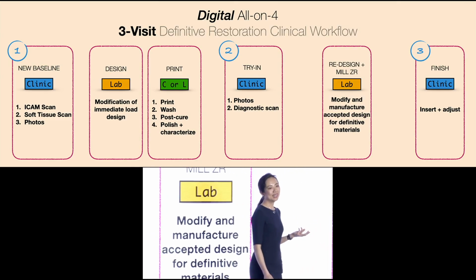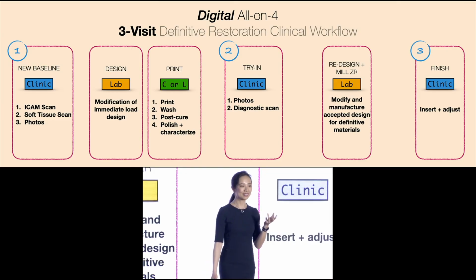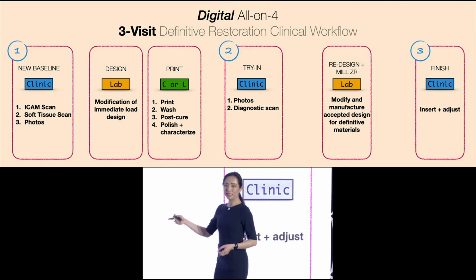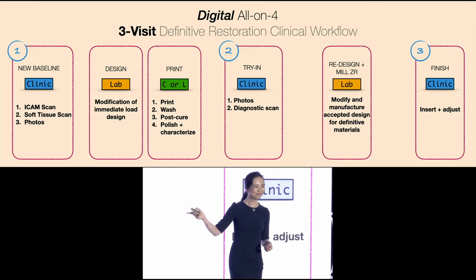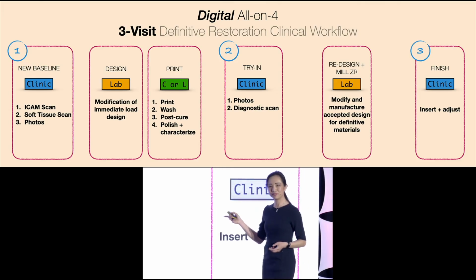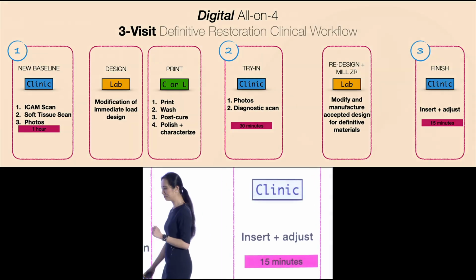So we're at this point in time where we can literally just copy an existing printed restoration and go, let's just take this to zirconia. This is a massive game changer for FP1s because now you can actually have full control of the soft tissue surface and predictably do it.